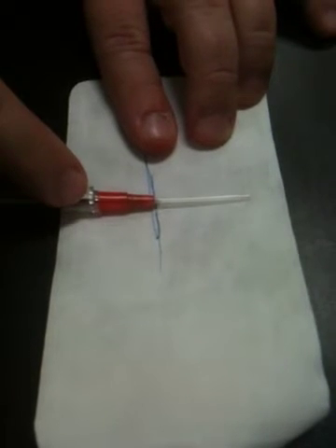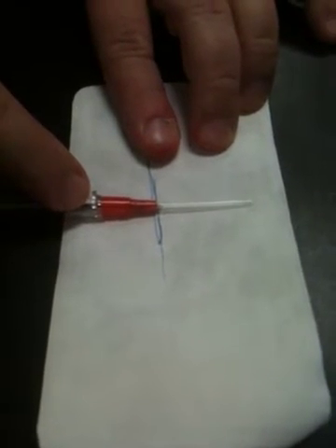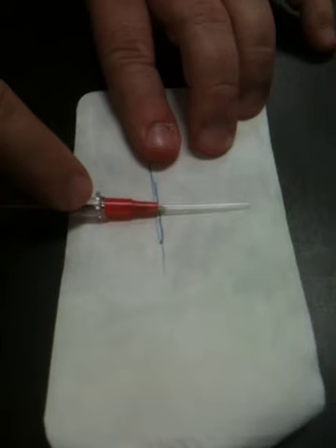And then we'll pull that needle on back and safety cap it. And you'll see the whole cannula seated in the vein.